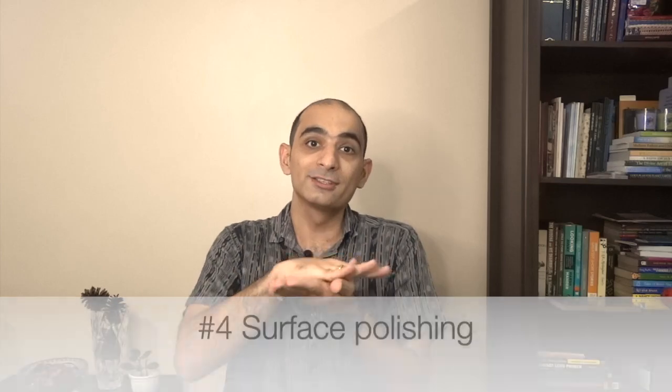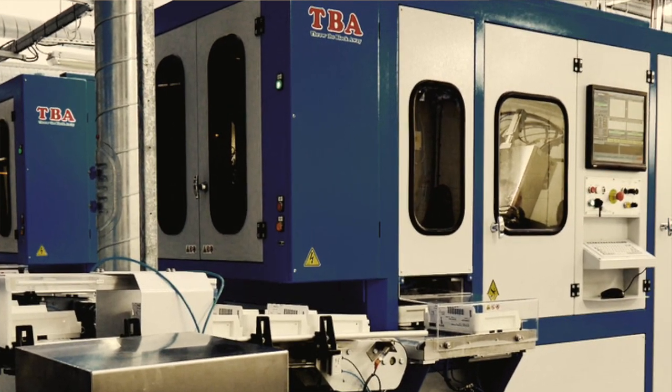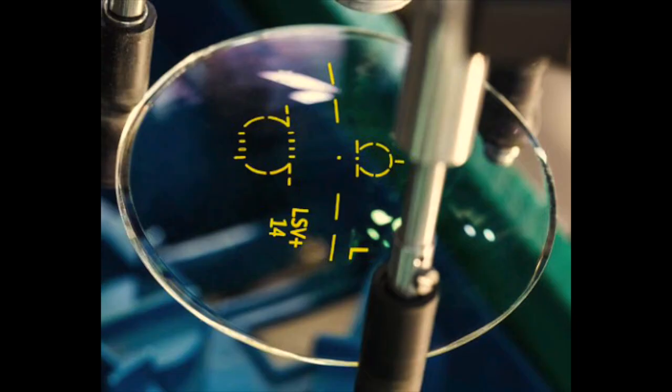Surface polishing. After the surface is generated, it is polished to ensure a smooth and clear surface. The polishing process removes any surface imperfections and creates a lens surface that is free of distortions.